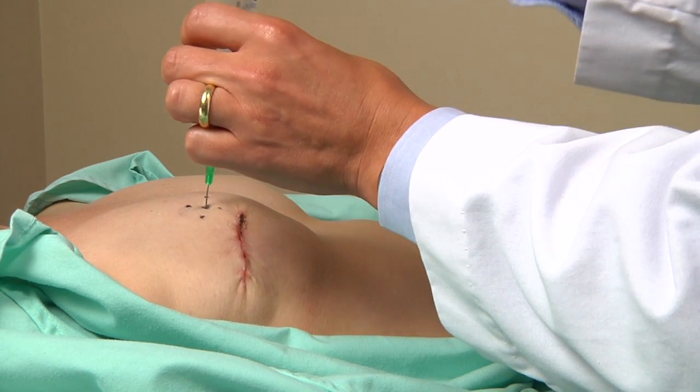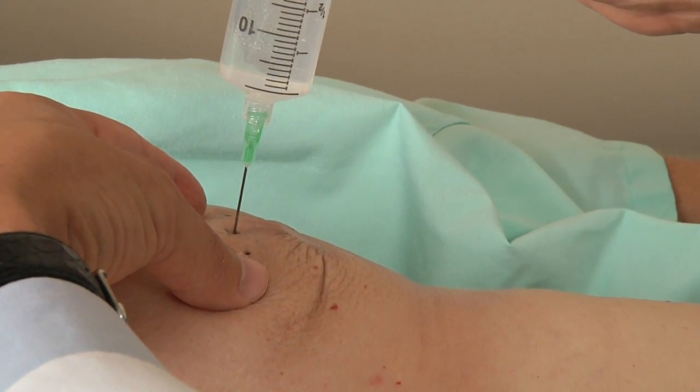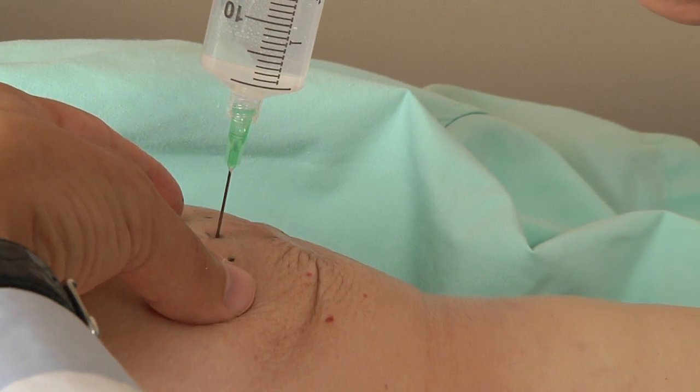This confirms the correct location of the needle. With some tissue expanders the fill port may become tilted; ideally the needle should enter the fill port at near 90 degrees to avoid the risk of going out the side of the fill port. Preferably the needle would not be pushed firmly against the end plate to avoid creating a burr on the needle which could damage the fill port.